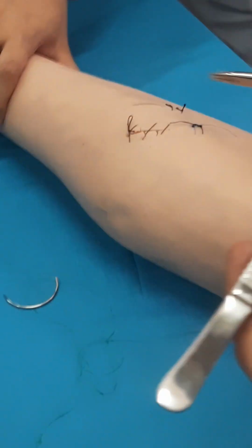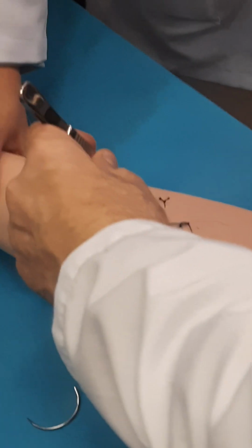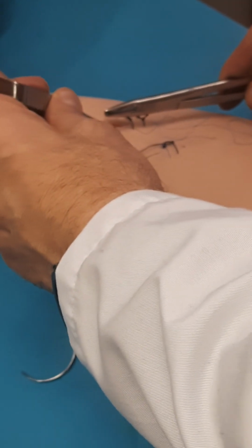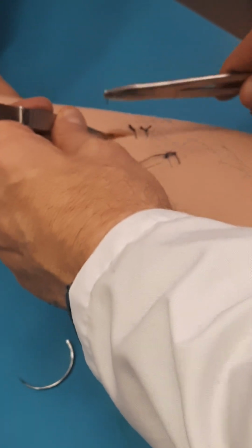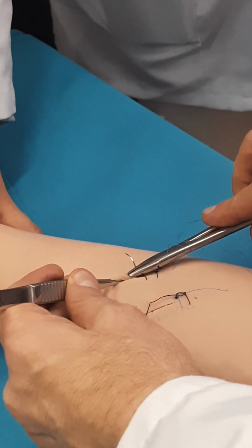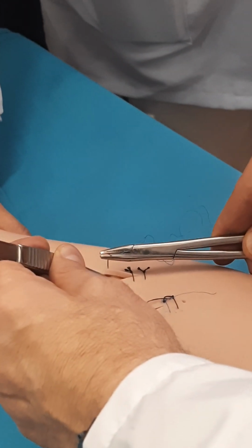Now look at me. I have here the incision, yeah? How do we work? You see the pen gripping position? In this pen gripping position, I fix the margin. After this, look here please, I place my needle absolutely perpendicular. Look, it is perpendicular, 90 degrees. Don't put it in that way. Don't put it in this way. 90 degrees means that.